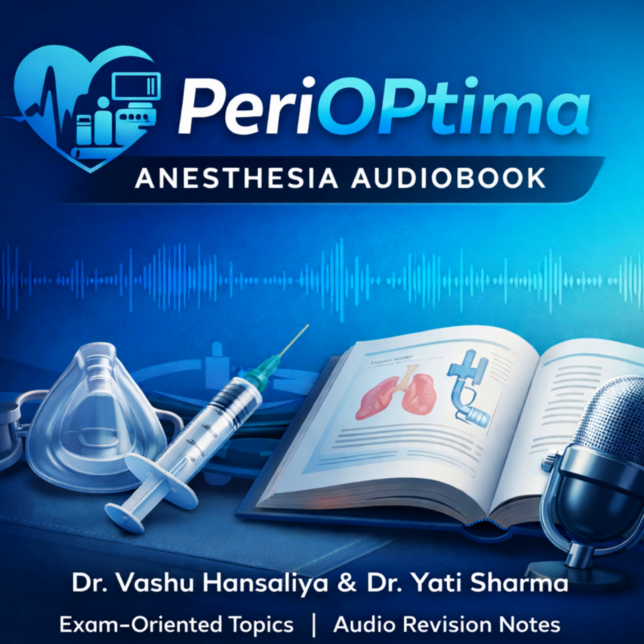But I think the most critical preparation step isn't mechanical, it's physiological, right? The depth of anesthesia. Absolutely. Insertion must occur during a period of adequate suppression of pharyngeal and laryngeal reflexes. If those reflexes are active, you risk coughing, retching, and catastrophic laryngospasm. You must emphasize that while muscle relaxants are not needed, adequate depth is. Propofol is specifically cited as a highly suitable induction agent because of its excellent properties in suppressing those laryngeal reflexes, which facilitates a smooth placement.